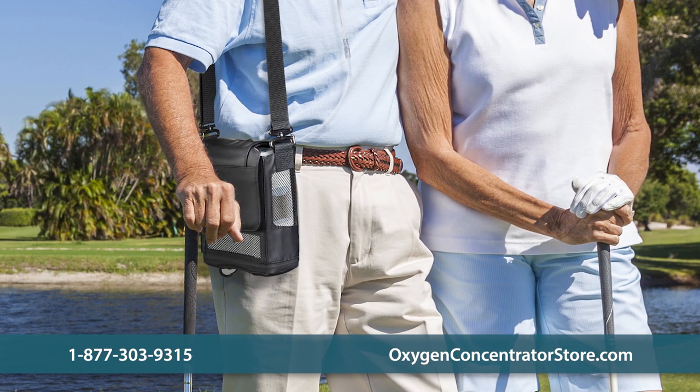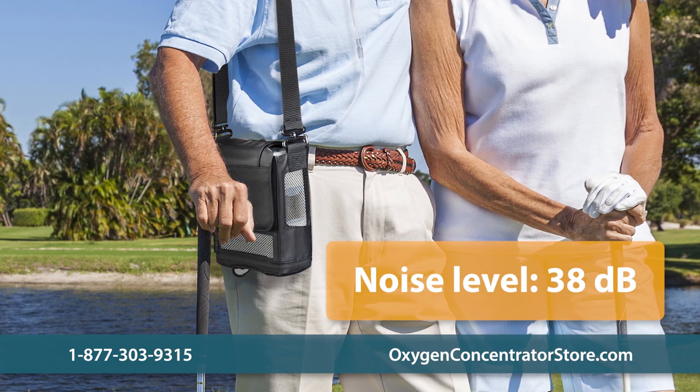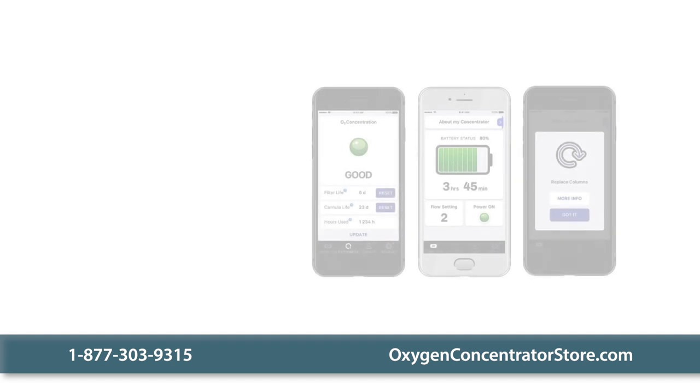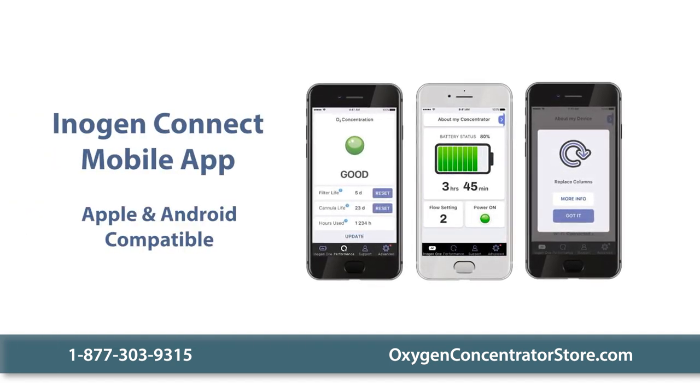The G5 is one of the quietest portable concentrators. At 38 decibels, it produces less noise than a normal indoor conversation. The free Inogen Connect mobile app allows you to monitor your unit through any Apple or Android device.